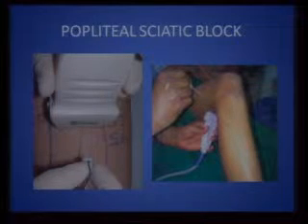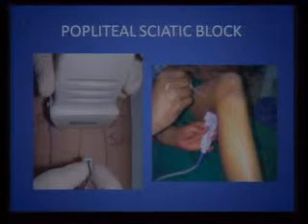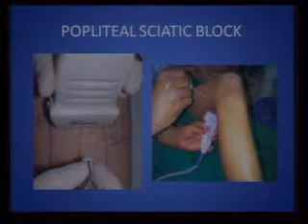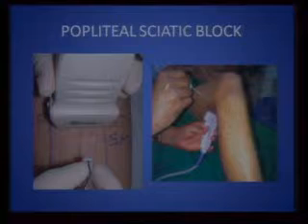but then you have to make sure, as Dr. Kapil said, the alignment between the ultrasound beam and the needle is always there so that you can see the needle.